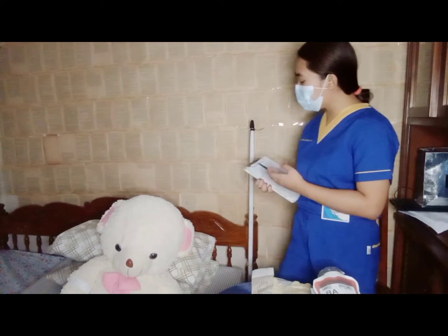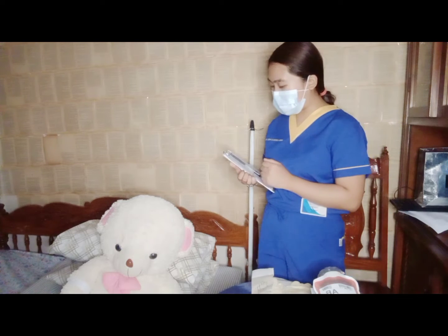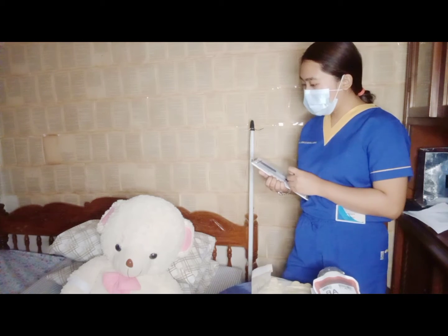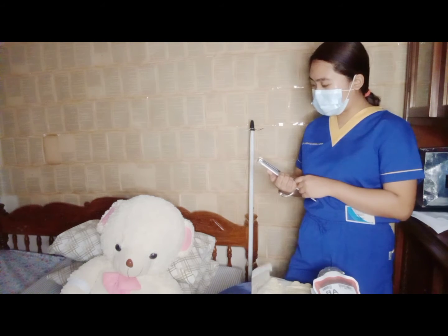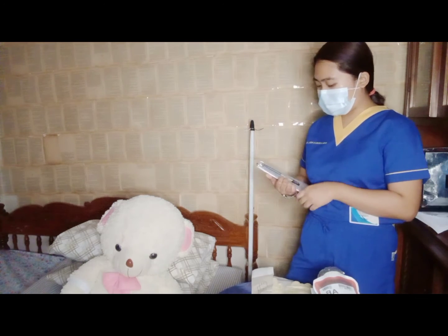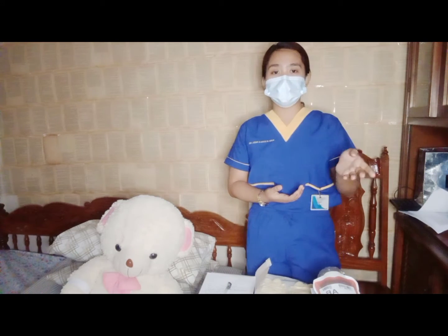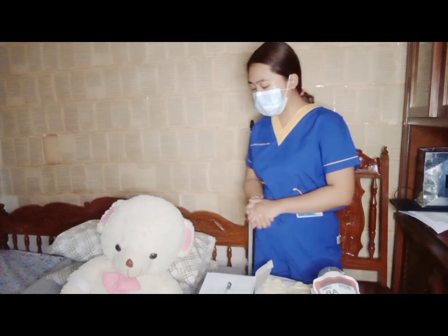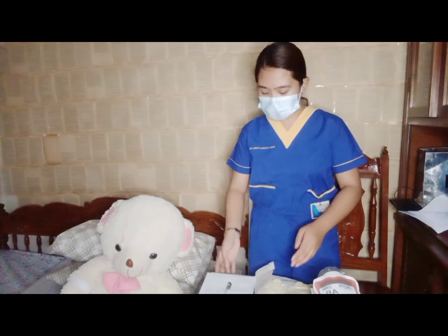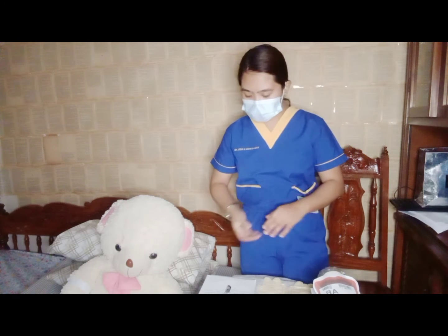Okay, so, habang sinasalinan po kita mamaya ng dugo is, i-report niyo po sa akin kung may nararamdaman kayong kakaiba, like chills, itching, irritation, rashes, or other unusual reactions. Okay po ba, ma'am? Okay, so, prior to the procedure, I've already closed the door to provide privacy for the patient. Okay. So, ma'am, mag-relax ka muna dyan at i-validate po muna namin itong infos ninyo, okay? So, two nurses will validate the information.